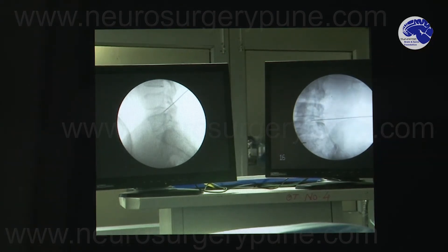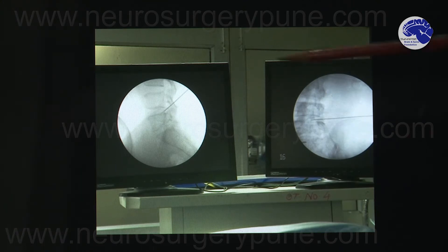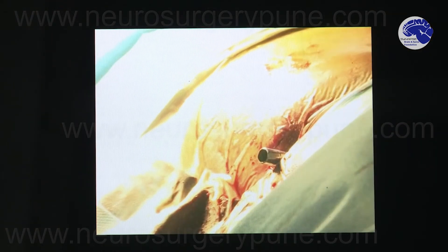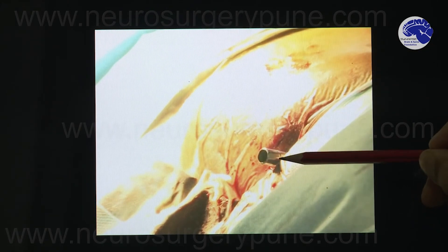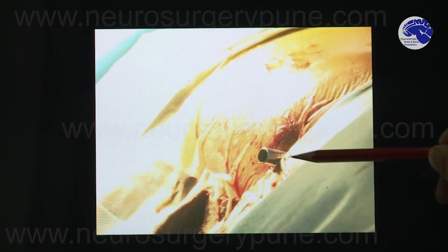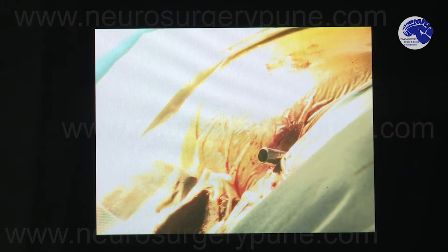This initial placement of the needle is very crucial and has to be absolutely accurate. Over this needle we pass the dilators and then the channel through which the endoscope is passed. You can see a very small channel passed over the needle; the needle is then removed, and this portion has been numbed with local anesthesia so the patient is not aware of anything going on.